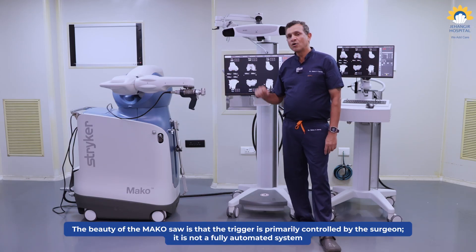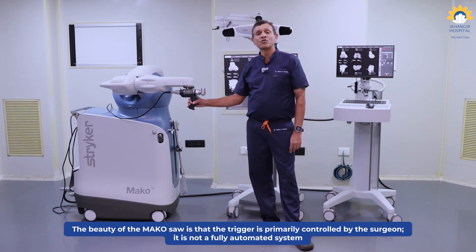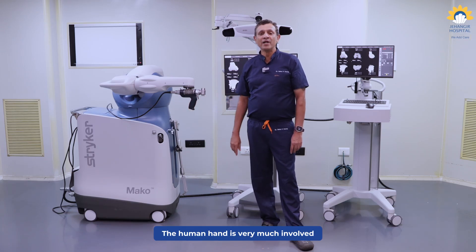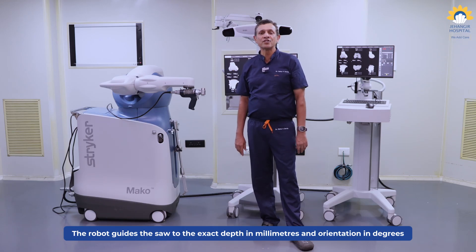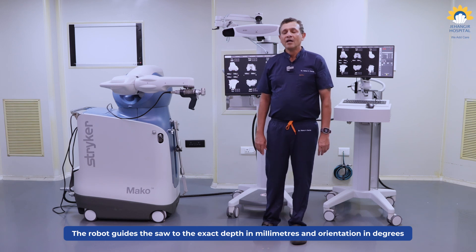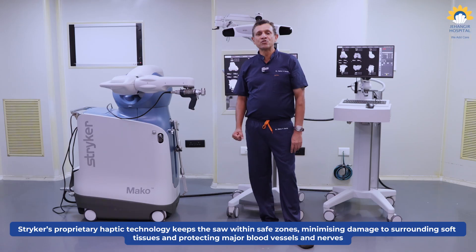The beauty about the Mako saw is that the trigger, which is primarily in control of the surgeon, it's not a fully automated system in that sense. The human hand is very much into play. The robot helps us guide up to the exact depth, that is in terms of millimeters and the orientation in terms of degrees, and the proprietary haptic technology from Stryker helps us keep the saw in the safe zones, meaning there is very less damage or almost no damage to the surrounding soft tissues, and it protects the surrounding major blood vessels and nerves.